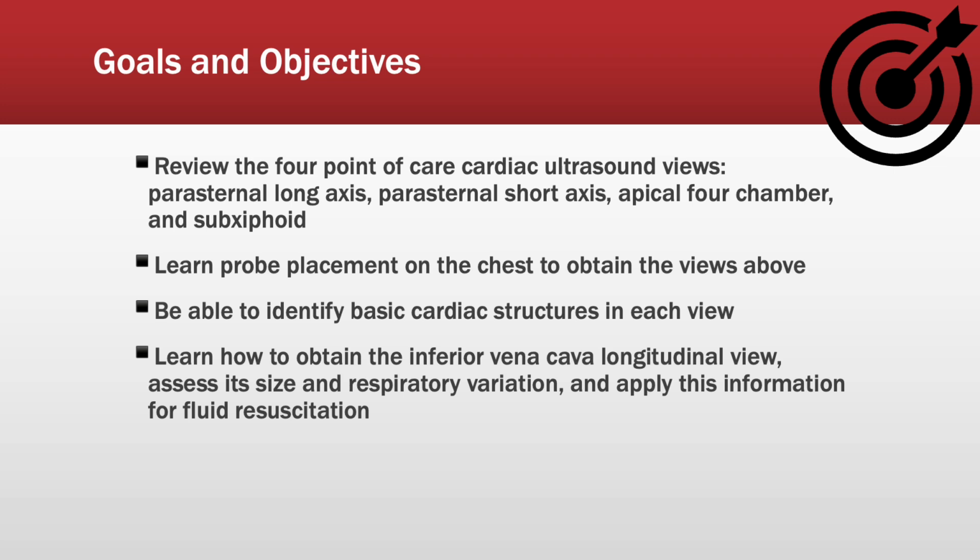And finally, learn how to obtain the inferior vena cava longitudinal view from the Subxiphoid and right upper quadrant approach, as well as assess its size and respiratory variation, and use this information to determine the patient's volume status and guide the fluid resuscitation.